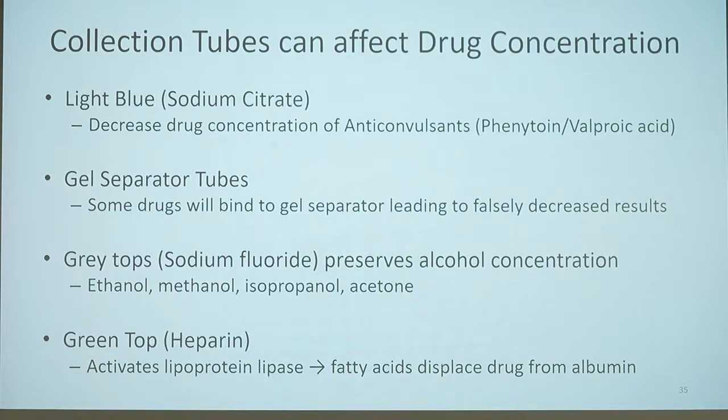And then the green top tubes contain the additive heparin. Heparin activates lipase enzymes. So it's going to break up the triglycerides, and those fatty acids are going to basically kick the drugs off of albumin and bind to the albumin themselves.